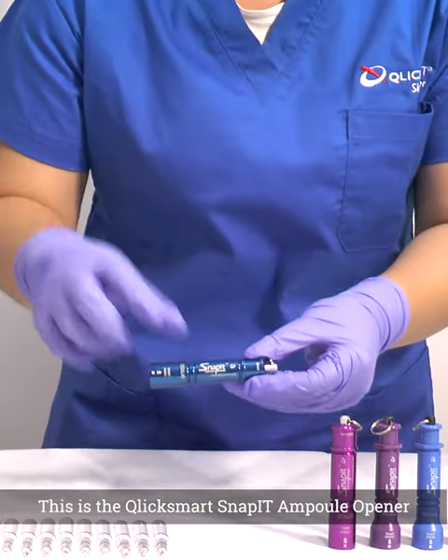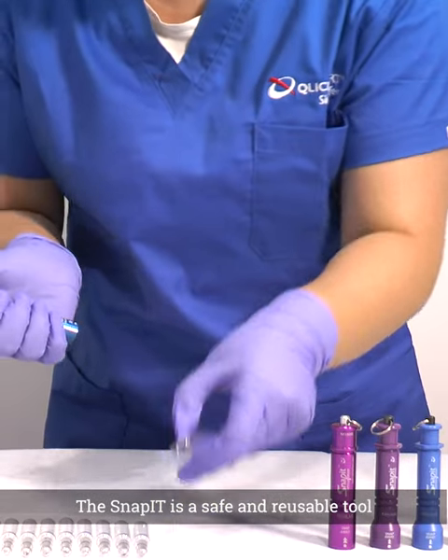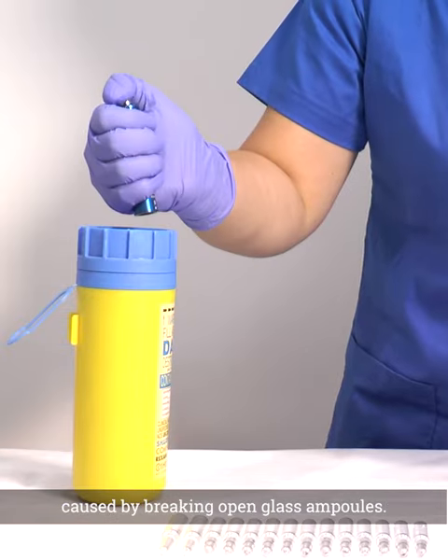This is the Qlik Smart Snap-It Ampoule Opener. The Snap-It is a safe and reusable tool designed by an Australian nurse to minimise injuries and waste caused by breaking open glass ampoules.